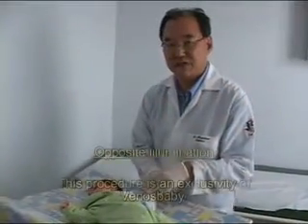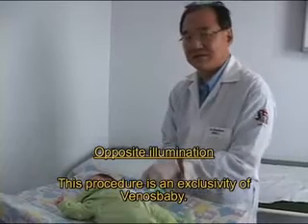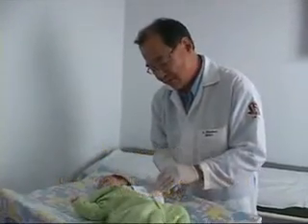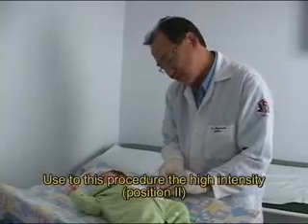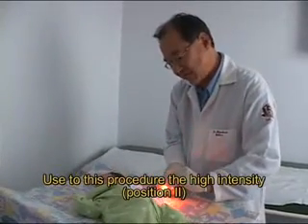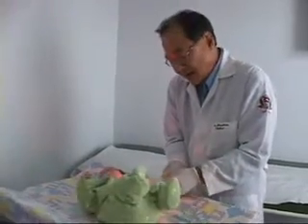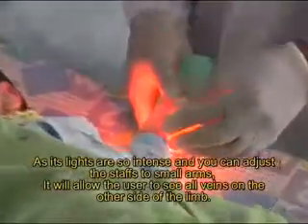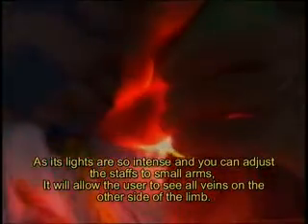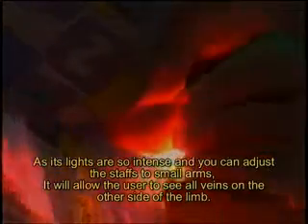The second method is opposite illumination. This procedure is exclusive to the VENOS BABY. For this procedure, we will use the high-intensity setting of VENOS BABY. As the light intensity is very high, you can see all the veins on the other side of the hand.